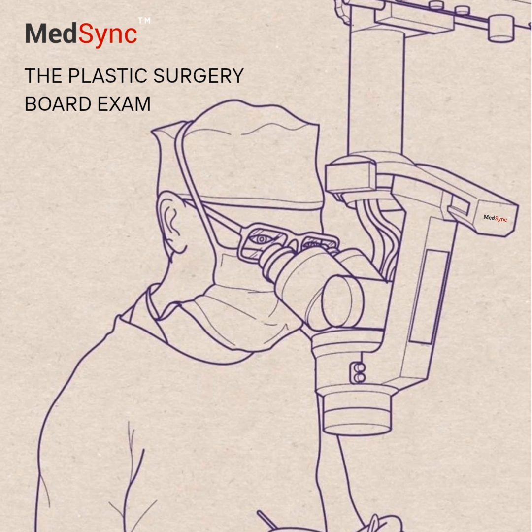Okay. And chronic wounds, pressure ulcers, venous ulcers. Again, debridement is paramount. I've got to remove that non-viable stuff. NPWT can then help kickstart a stalled chronic wound, almost converting it into a more acute state that responds better. Makes sense.